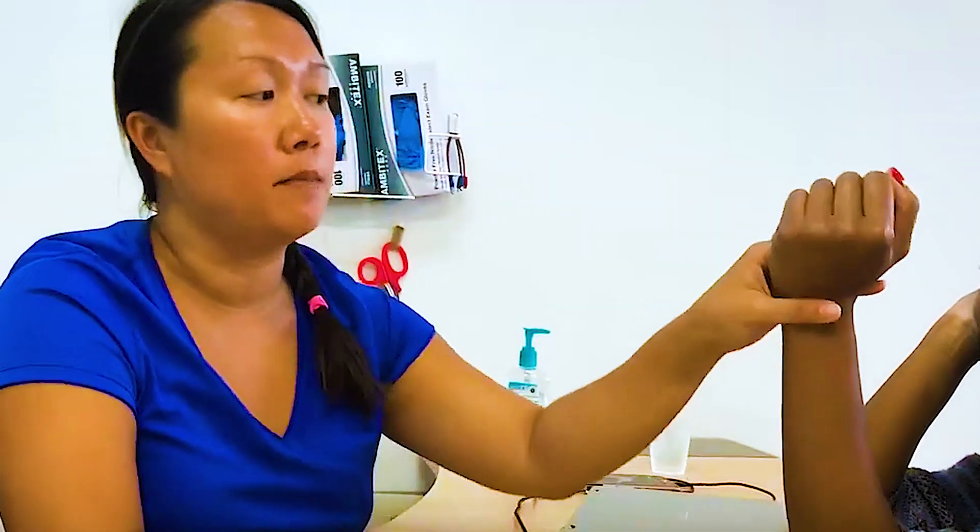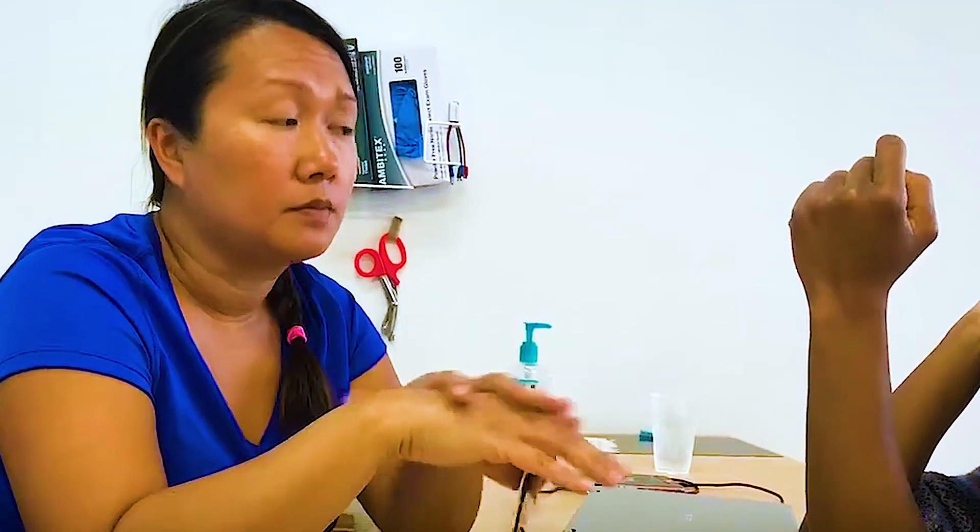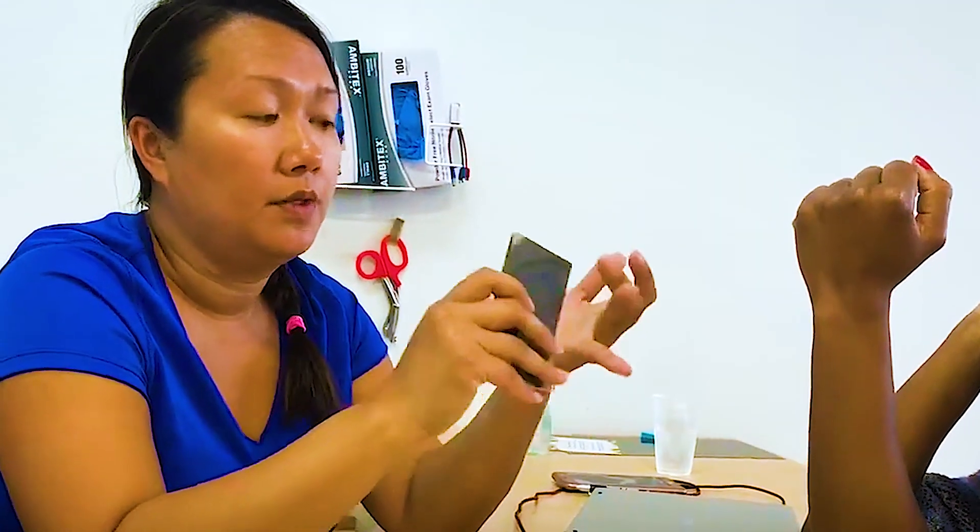We always measure wrist extension on the volar side and we always measure wrist flexion on the dorsal side. If you're changing that, you have to notate it. Otherwise it's going to show too big a discrepancy in our notes where you don't know if that person is making progress or not. So that's finger and wrist.